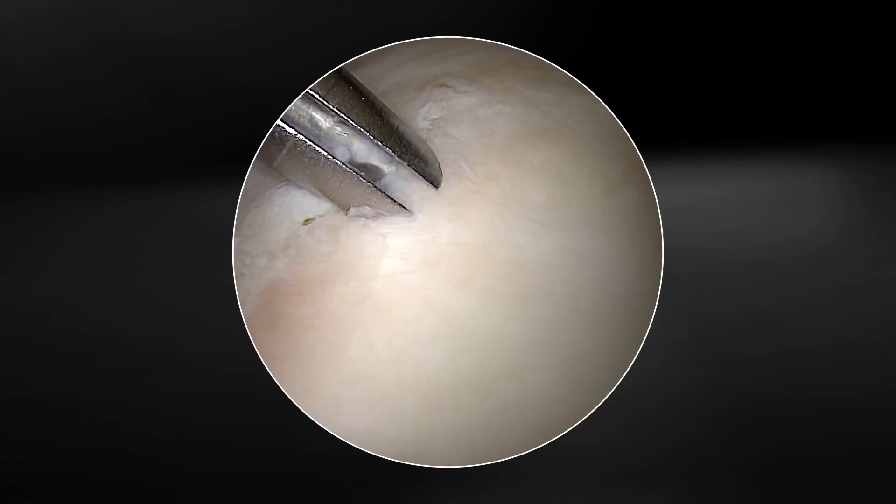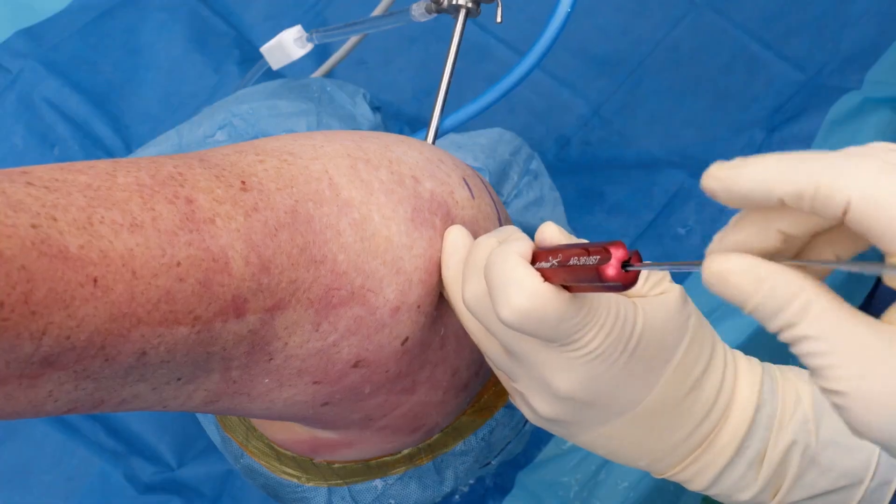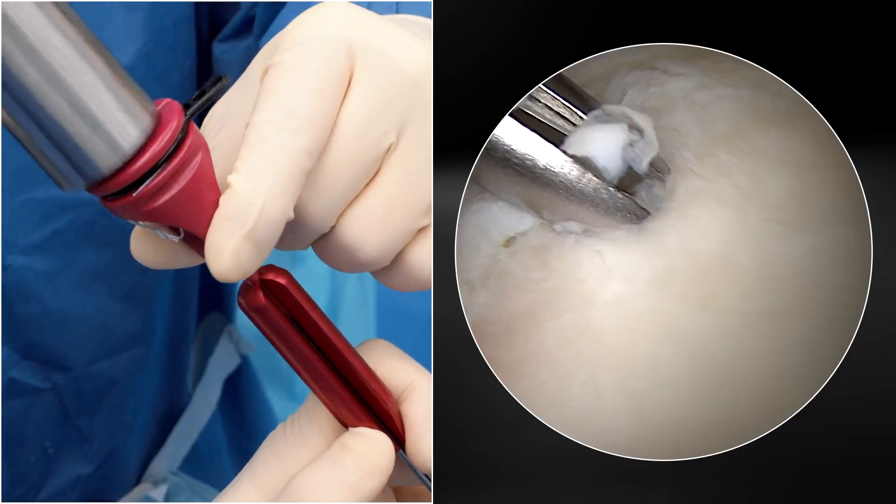Go ahead and drill the hole and advance the 1.8 knotless fiber tack through the guide and mallet until flush with the guide handle.